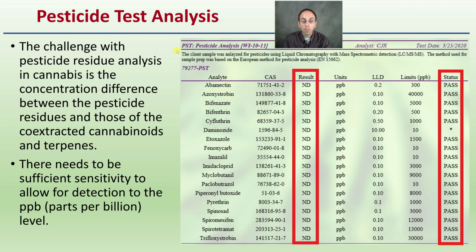And again, now we see a great extensive list provided here. Labs simply can't test for every single pesticide, so a lot of the common ones are provided here, but just keep in mind that no lab is testing for every single possible pesticide. You want to see a comprehensive list and, of course, a passing mark for all of the pesticides tested or listed, so that they're all below or at non-detectable levels to get a passing mark for the pesticide test analysis.